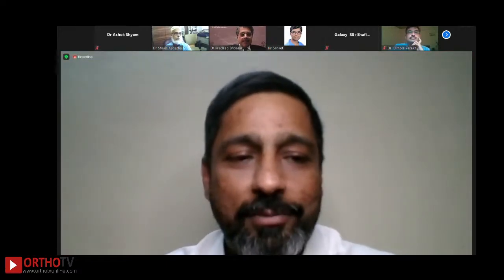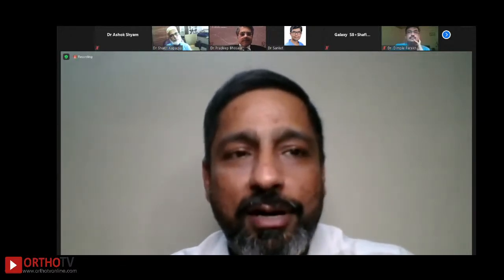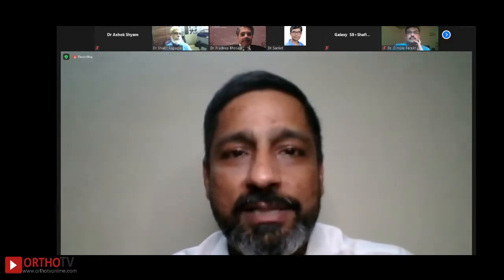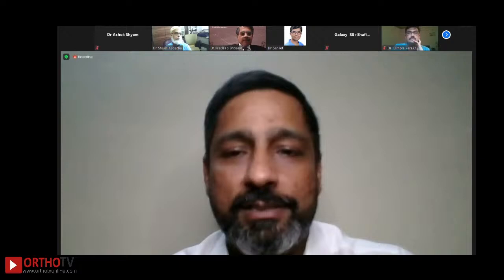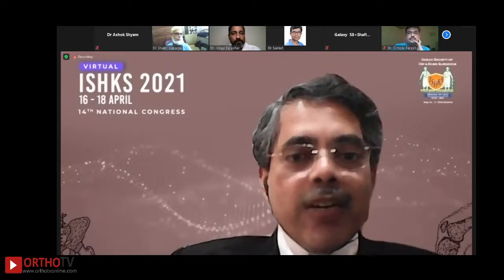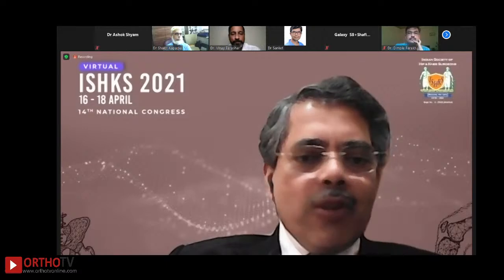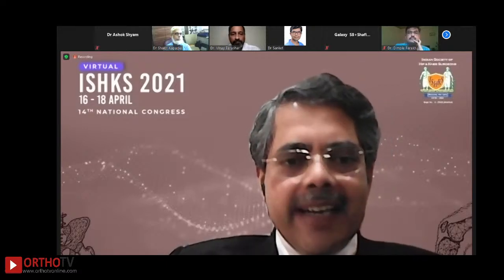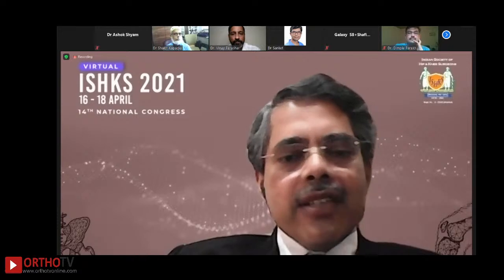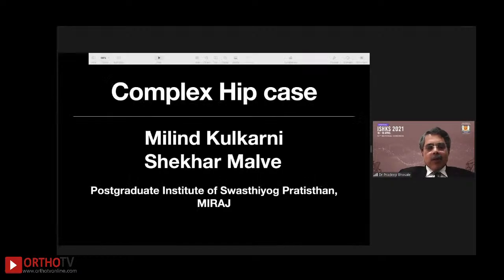Dual mobility in young patients is in any case a burning issue, and I per se am not a very big fan of using it in younger patients. But Bhosle sir, what is your take? When would you want to use it in a younger patient? Yeah, only when the acetabular size is such that we need to use a 22 millimeter head, with a 40, 44 millimeter reamer size, and you have to go forcefully for a 22 millimeter head. In those cases, selectively, you must use dual mobility, even in young people, because with 22 there is a very high risk of dislocation. So avoid a 22 millimeter head.